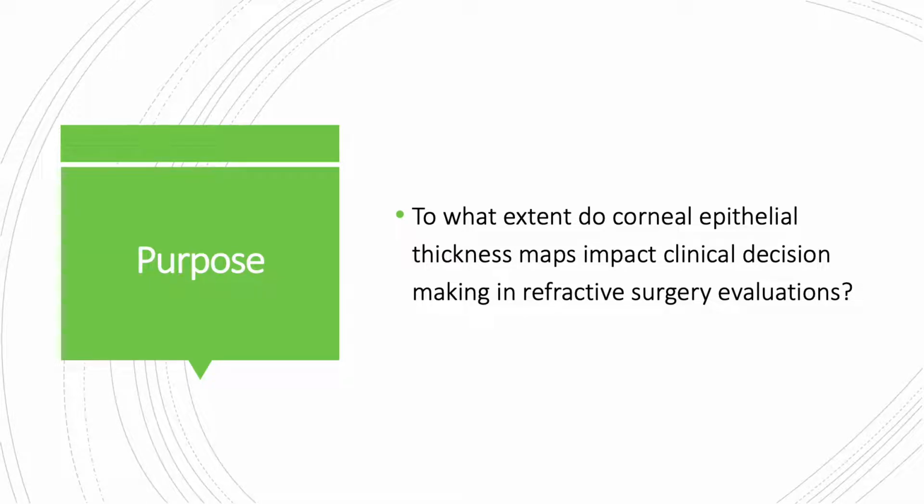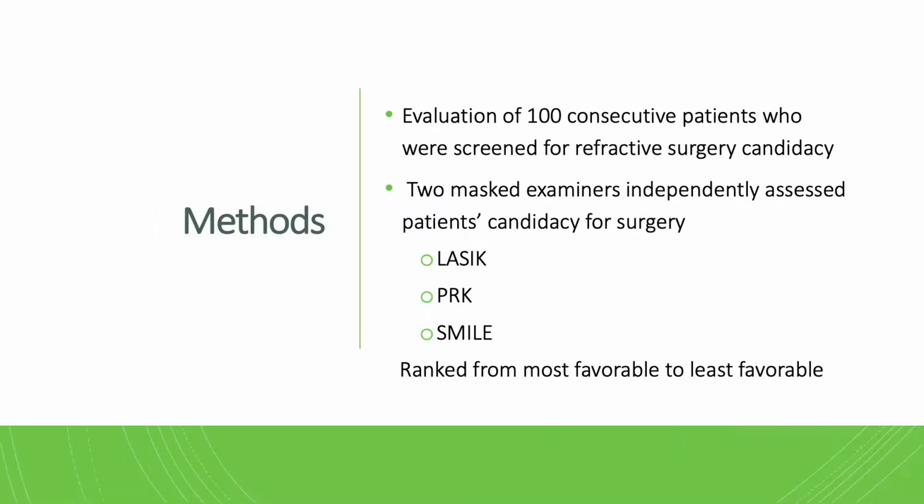So the aim of our study was to determine the extent to which epithelial thickness maps impact decision-making in refractive surgery evaluations. To this end, we conducted an evaluation of 100 consecutive patients who were screened for refractive surgery candidacy. Two masked examiners independently assessed patients' candidacy for each of LASIK, PRK, and SMILE, and these 3 surgeries were ranked from most favorable to least favorable for every patient deemed an eligible candidate for surgery.